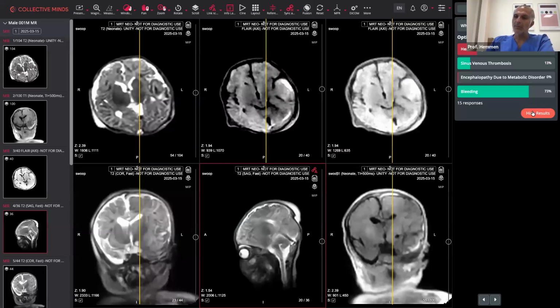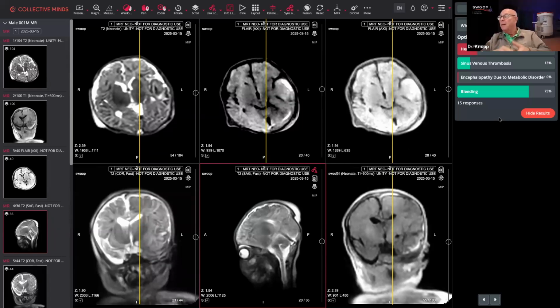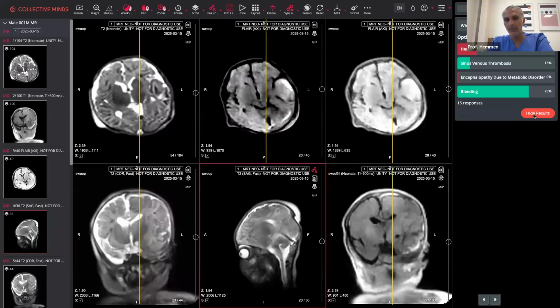No, I mean, there's both etiologies. So it might be a hemorrhagic infarct or infarction after an ischemic stroke, but there also might be a primary hemorrhagic stroke, which is, of course, much less often what we're calling neonatal stroke, as opposed to infarct. Yeah.